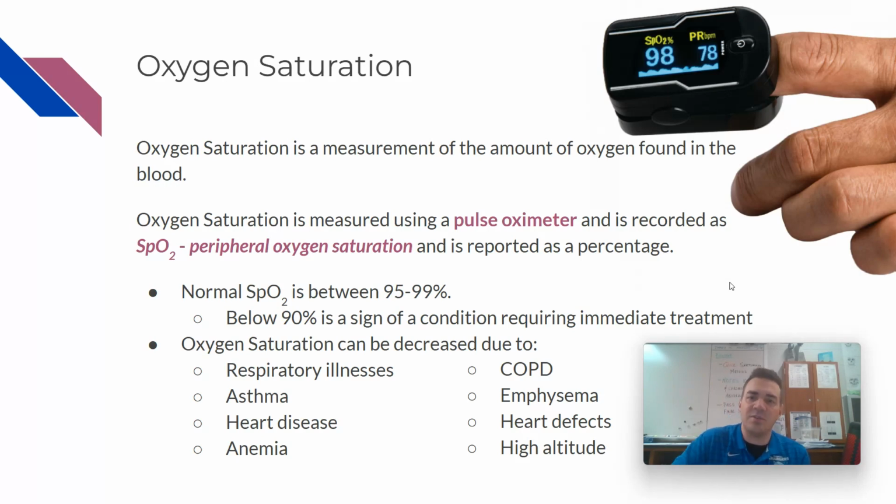And this is often done with something called a pulse oximeter, and you'll be using it over in the lab over there. We've got these. You turn it on, you clip it onto your finger, and it gives you both your pulse and your blood oxygen saturation, hence pulse oximeter. So just like you can see up here, we've got blood oxygen saturation, 98 SpO2 percentage, and we also have the pulse here in BPM, beats per minute. So this person's 78 BPM, right in the normal range, and a nice healthy oxygen saturation there at 98 as well.